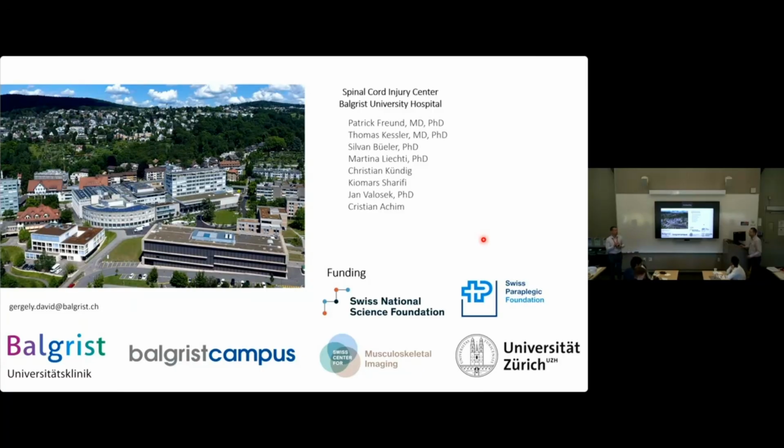Yes, so I think we should also consider what is the best sequence to acquire or to visualize the nerve rootlets. One study comes to my mind from a Chinese group who even put their data online, and they compared 3 different scans: the T2 weighted TSE, a DESS sequence, and a CISS. These are Siemens terms, and they found that the CISS sequence has the best visibility. This is the image that I showed you for the vasculature. We probably still want to do it on T2 weighted because that would be most clinically relevant for our needs.